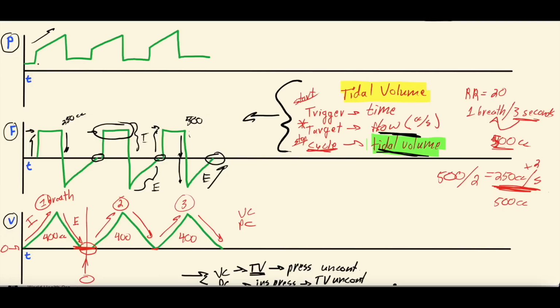And that's also why you get this ramped up pressure, because if you give a set flow rate, it's going to slowly build up the pressure in the lungs. Right? You got 2 lungs here. You got a trachea that goes into these lungs, and I'm pushing air in, and that air has to expand the lungs. But the lungs have a compliance, right? It takes effort to expand those lungs and overcome the lungs' compliance. But that in turn creates pressure pushing back, right? Because those lungs are expanding and kind of pushing back as they expand. And that's what causes the pressure that is created.